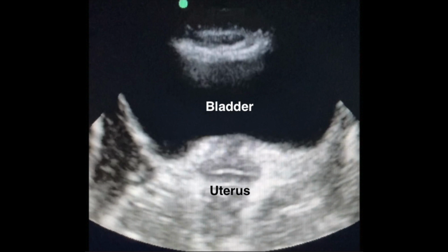Moving on to short axis of the female pelvis, we can see the uterus with the endometrial stripe, which is very hyperechoic in the middle. It looks a little bit like a flattened donut. And then we see the bladder anterior to that.